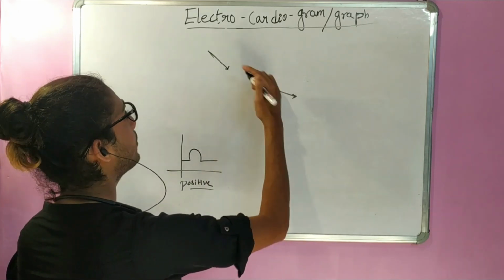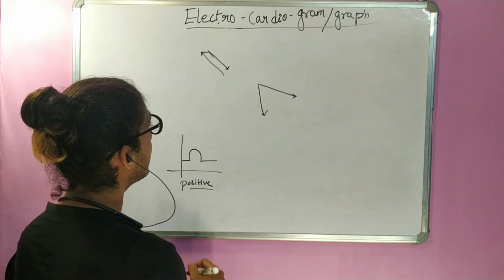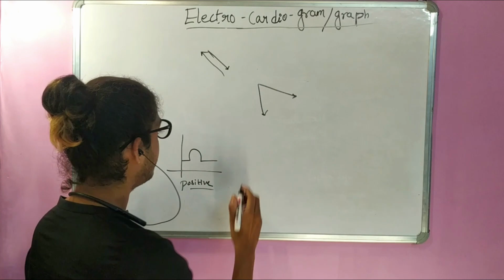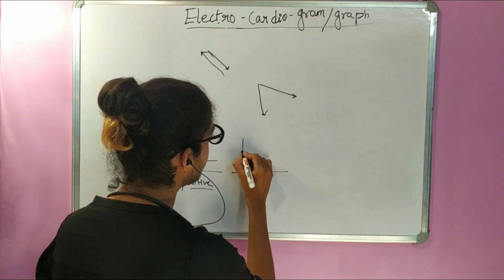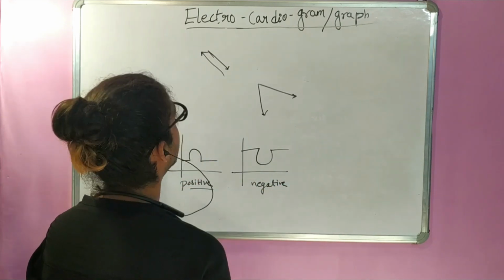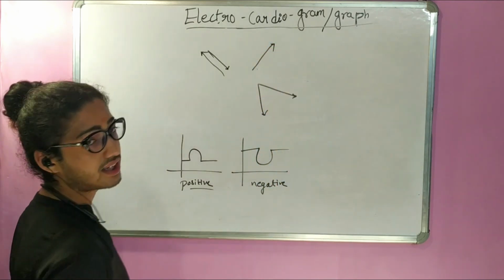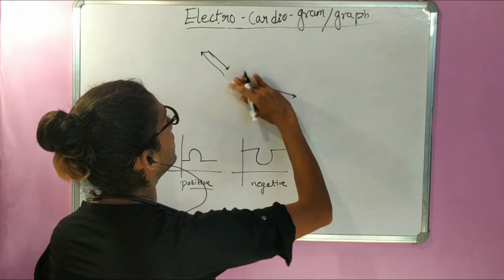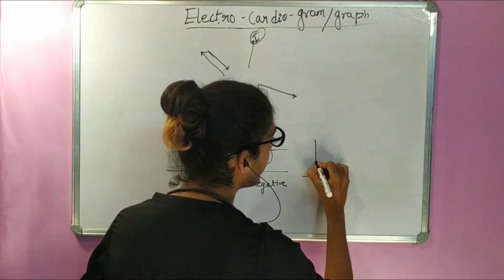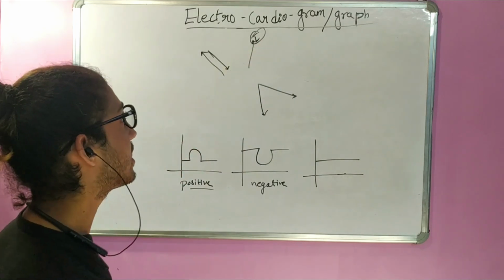At the same time, if you see AVR, augmented vector right, sensing it, because it is right opposite to the direction of the electrical activity, the wave generated will show a negative deflection. And if a very irrelevant lead is sensing this, suppose this one here, or probably lead 1, then you're going to see an isoelectric line, a straight line. That means no electrical deflection is measured by this lead.